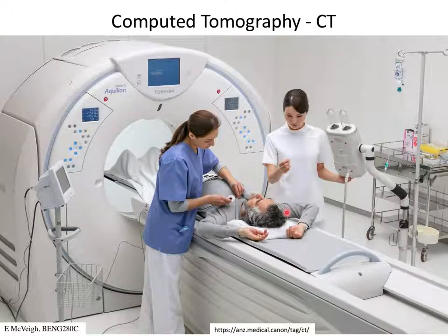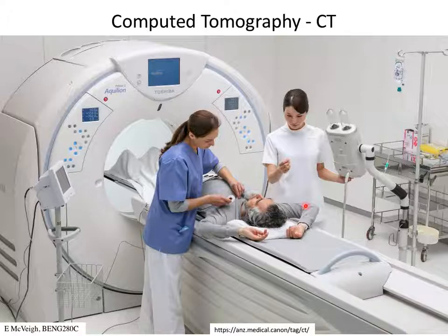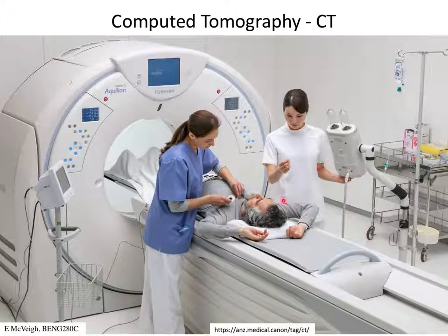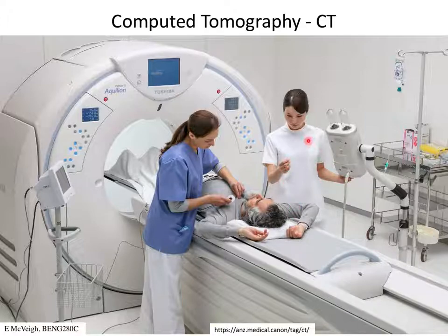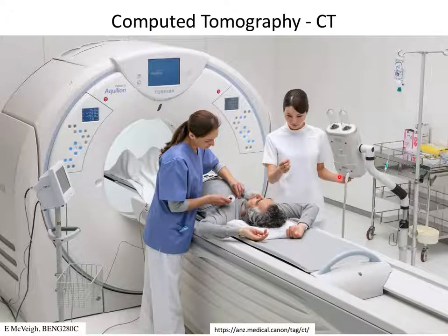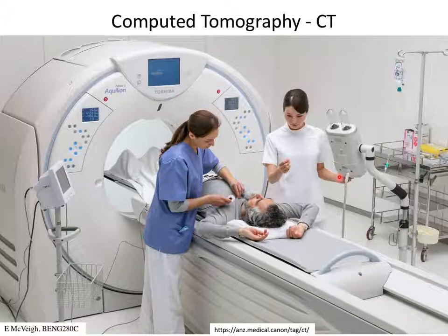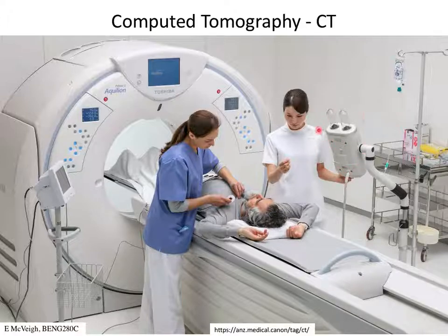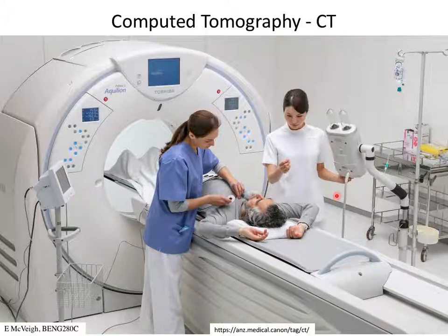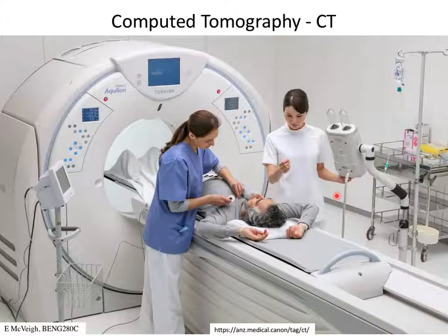The tech is about to connect a line — usually a needle in the antecubital vein — through which contrast agent will be injected into the patient. The dynamics of that contrast injection are quite important in cardiac CT. You want to take your images when the contrast agent in the patient's bloodstream is still at a fairly high concentration, because the contrast agent is what generates a lot of contrast — it casts a very dark shadow on the detector.